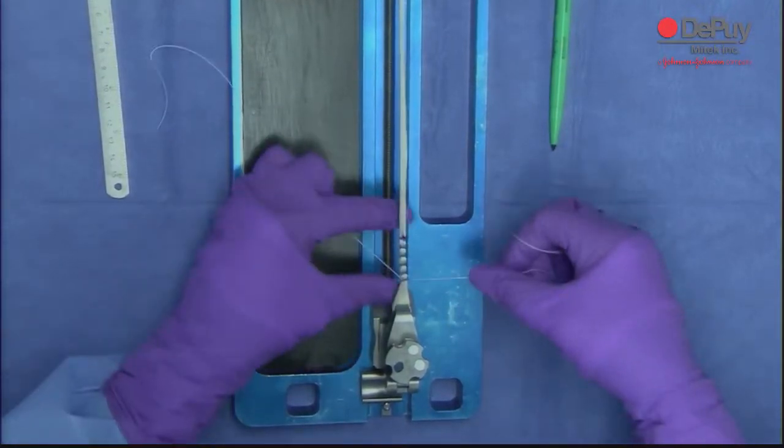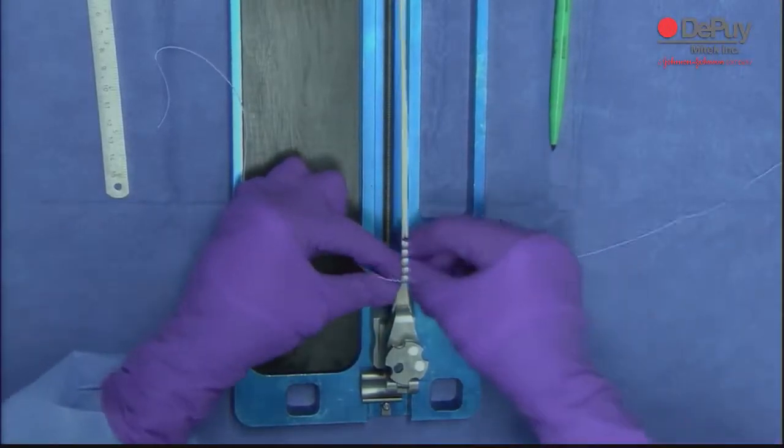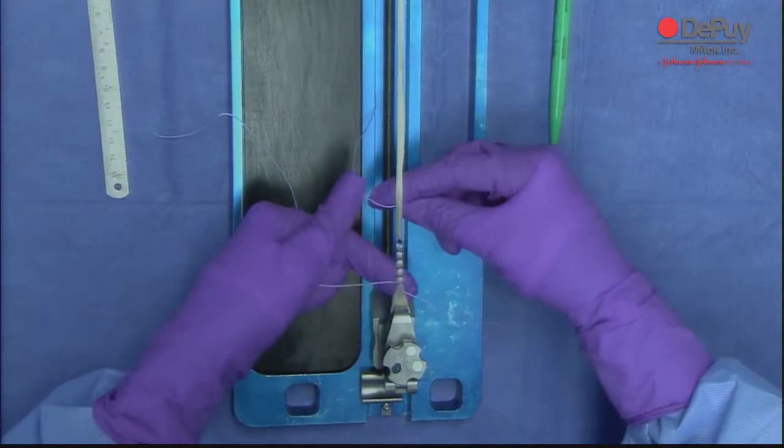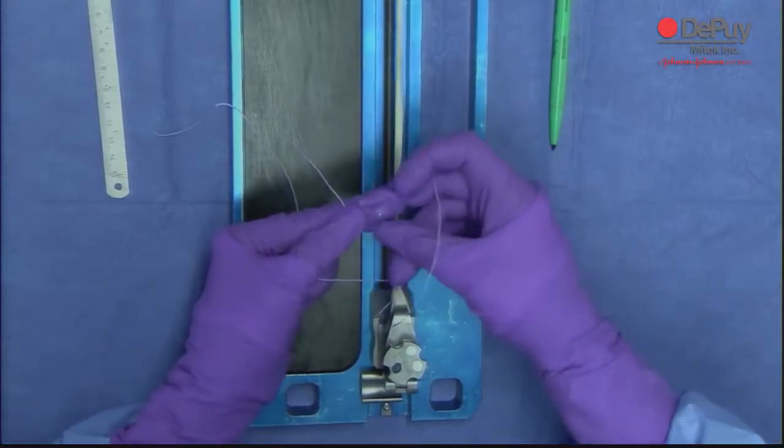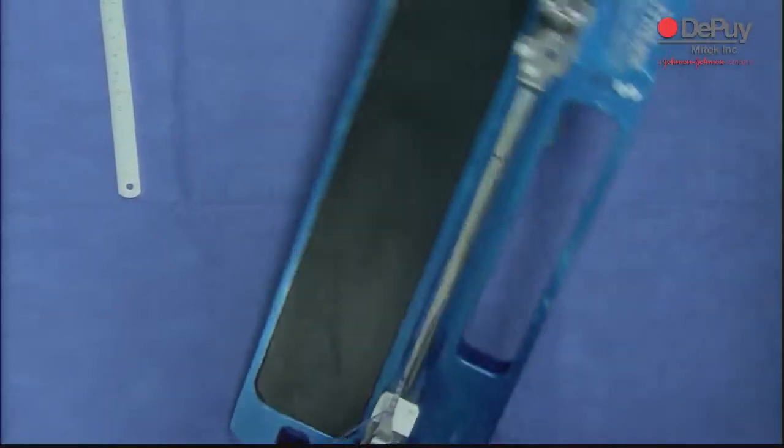Now at this point, I hold on to the one in my left hand. I take the suture and wrap it around once, twice. Now I'm going to bring the suture underneath the graft, into the little loop I made, and tighten it. That's it for that side. I'm going to move the graft.